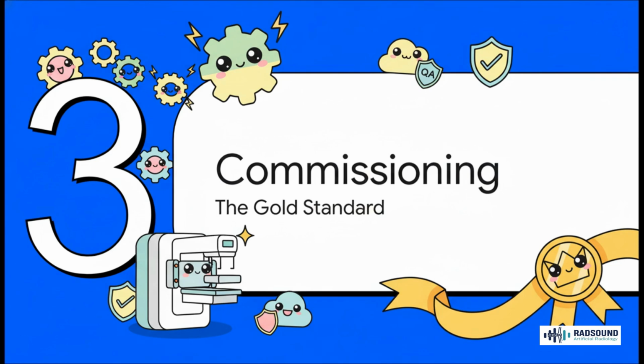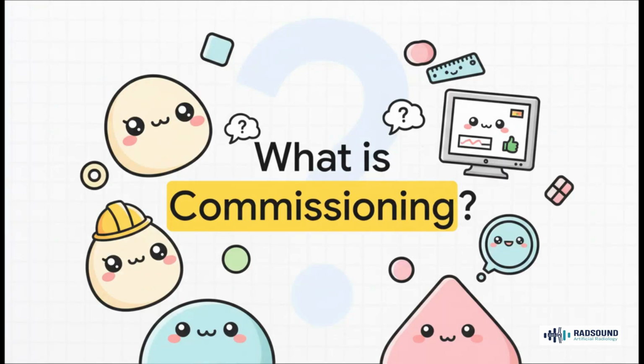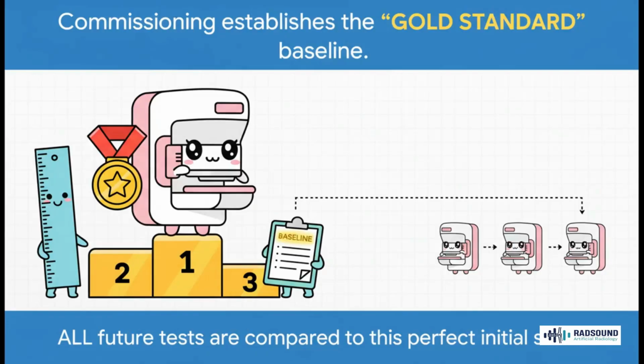Well, it all starts with the single most important event in the life of any imaging machine: commissioning. This is way more than just another test. It is the bedrock of the entire QA program. So what exactly is it? Why does it carry so much weight? It's because commissioning is what sets the baseline.